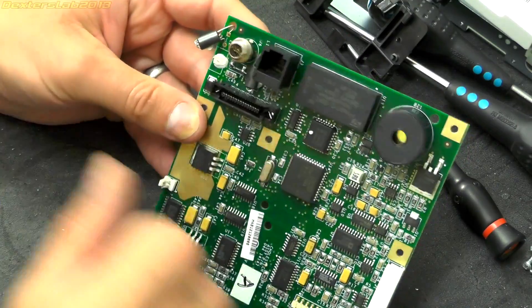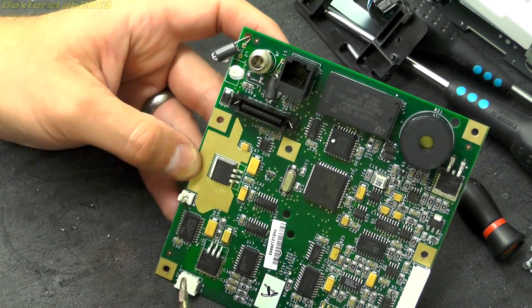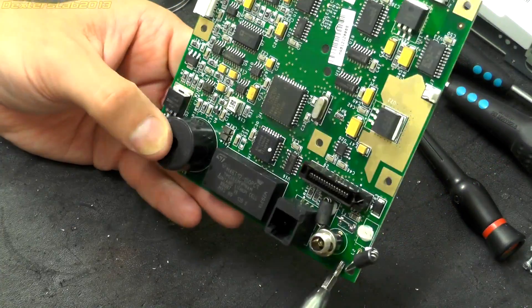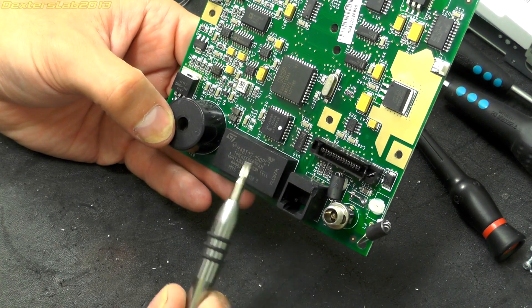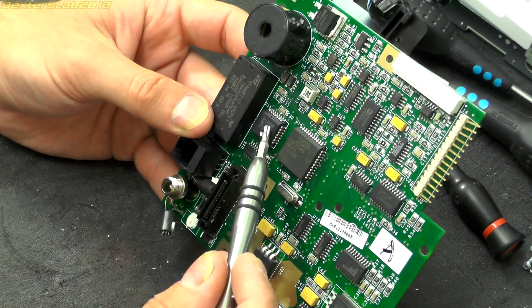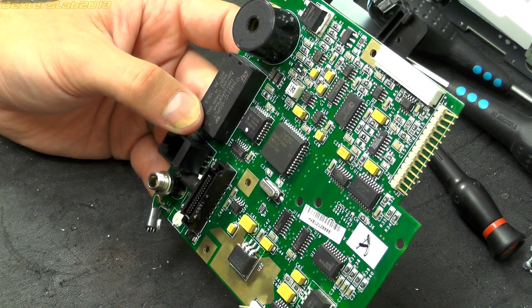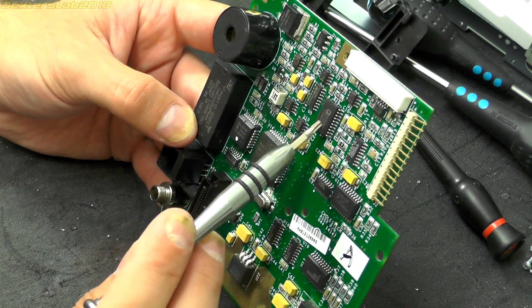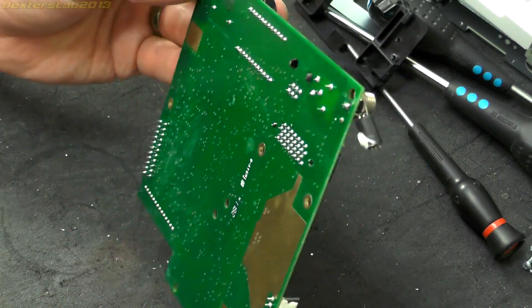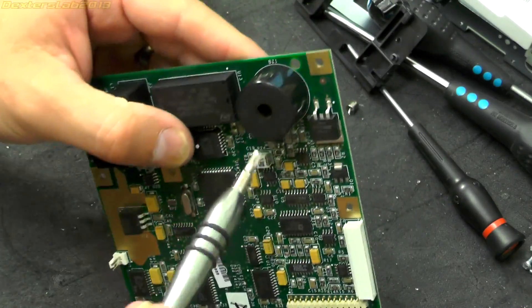Let's have a look at the PCB now. There's the power input and the printer output. The fuse that I replaced was just there—I just bridged in a bit of wire to bridge that. There's a voltage regulator just there. What we'll do is have a look at the main components first. We've got an ST timekeeper battery-backed RAM, so that's battery-backed RAM and a clock as well. We've got a GAL device, an NXP that's probably the processor, an ST micro IC just there, an Analog Devices chip just there that's probably the analog-to-digital converter, and some other bits and bobs. We'll have a closer look in just a moment. It's all on one side. I think it's a four-layer board, but all the components are just on this side. We've got a rather large buzzer just there.